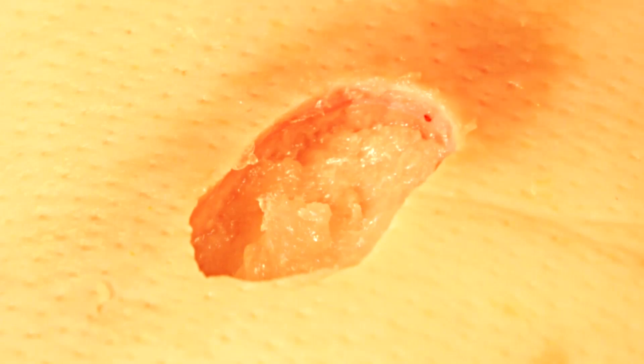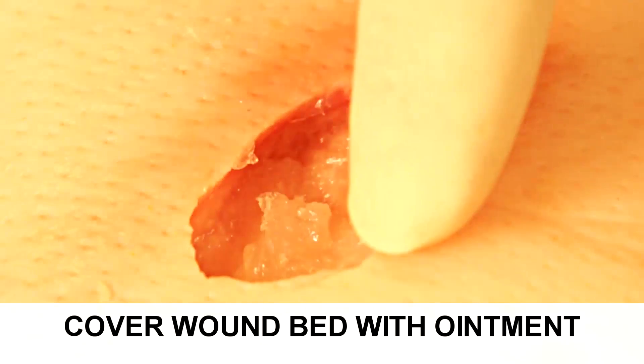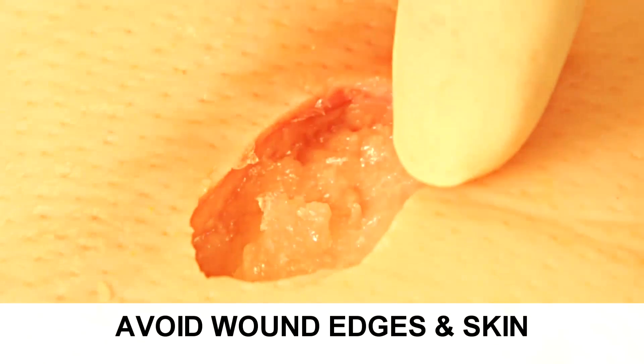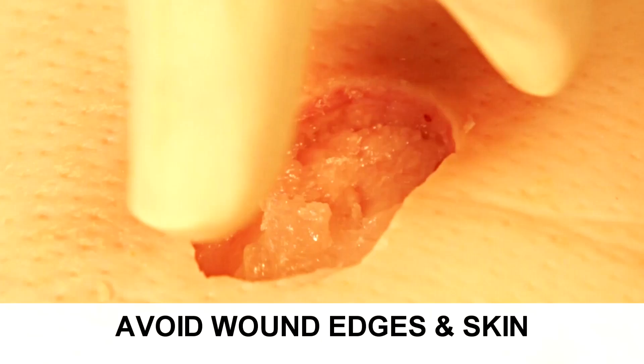After the application of the enzymatic debrider, you want to make sure that the base is fully covered and that there's not any of the enzymatic debrider on the wound edge and the peri-wound surface of intact skin, because that will contribute to maceration.